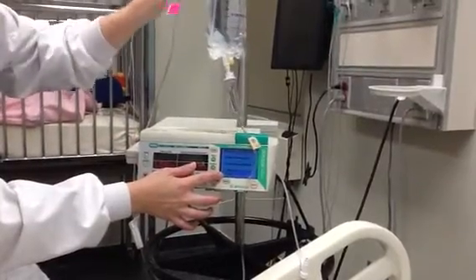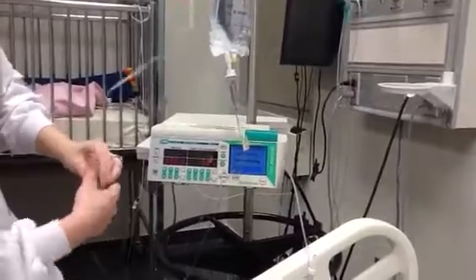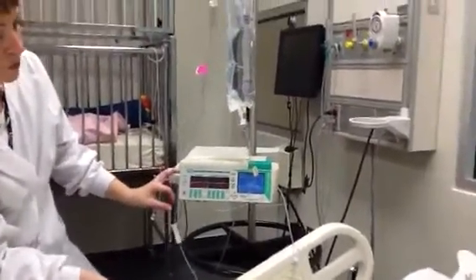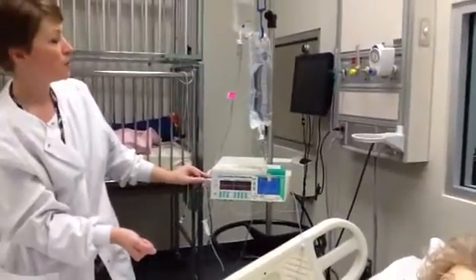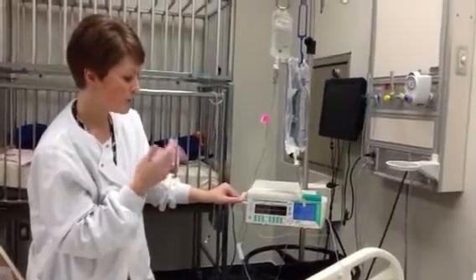Lower the primary bag, raise the secondary bag, open the roller clamp, and press piggyback run. So that is the way you can do a secondary tubing for when there's already a medication hanging in the room that has been empty.